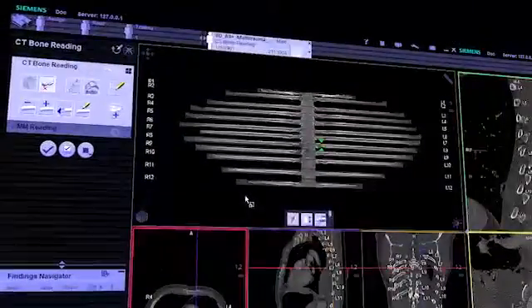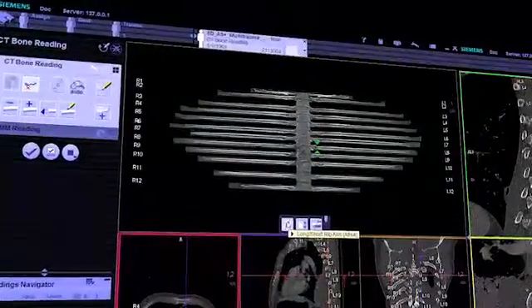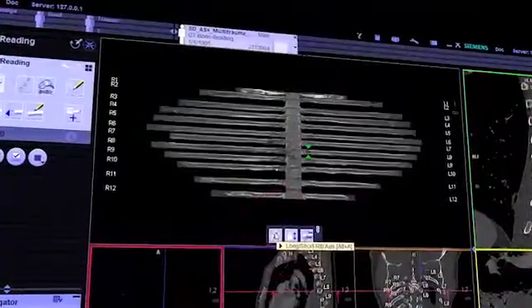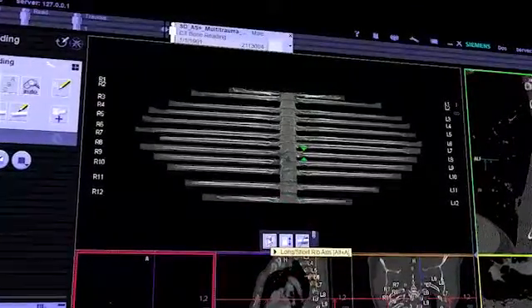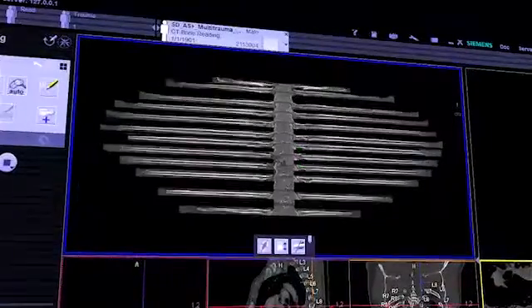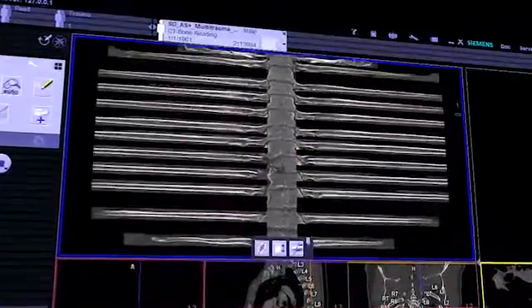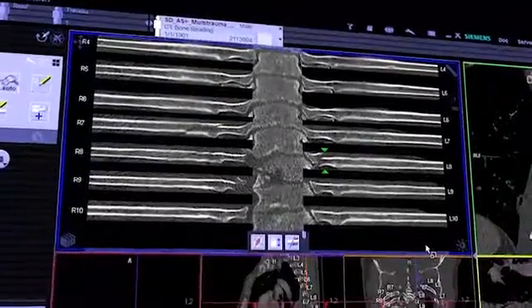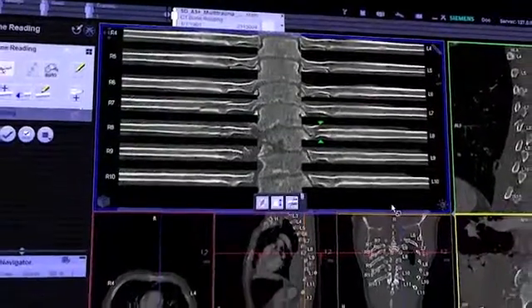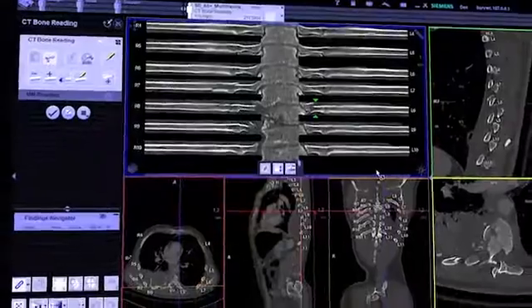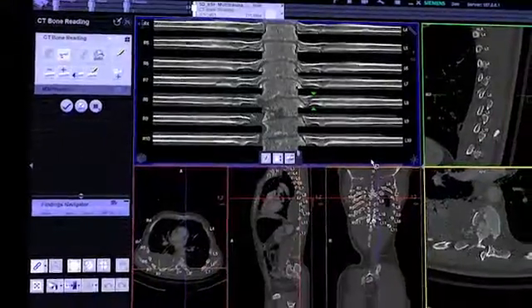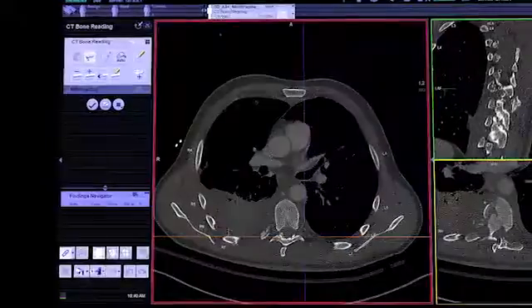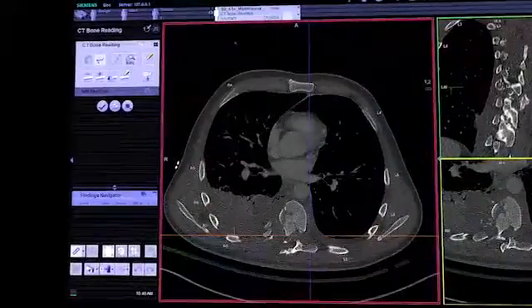Let's focus on the ribs first. You can easily toggle between the long and short axis view of all ribs. The planar display of the rib cage facilitates the detection of lesions right away. As you click on a fracture, the system centers the axial, sagittal, and coronal view around the point of interest. For a conventional assessment, the system always allows you to scroll through the axial slices as well.